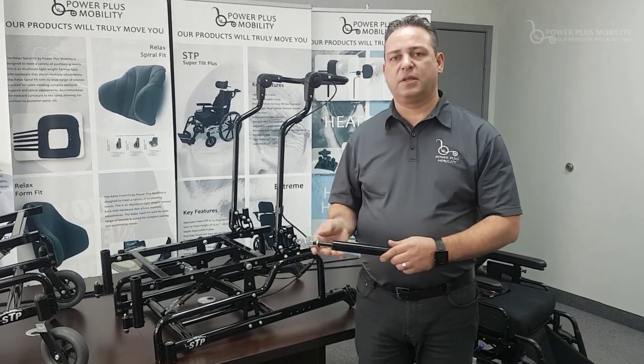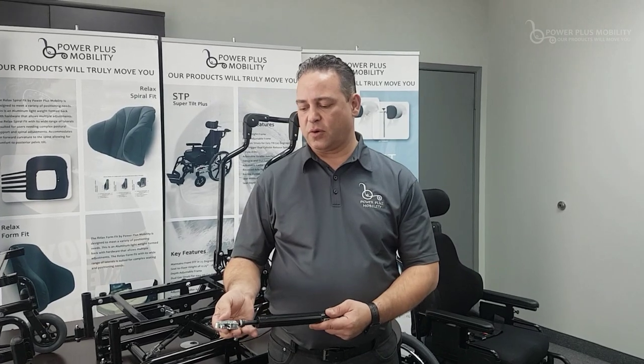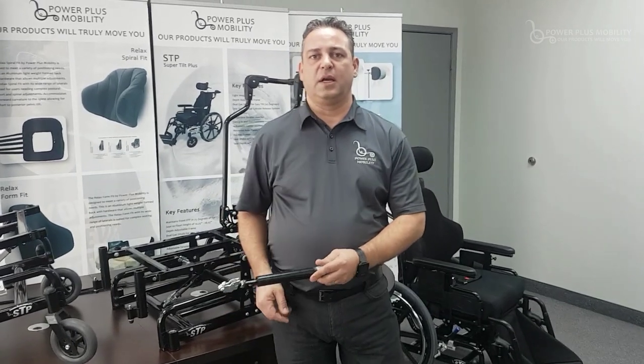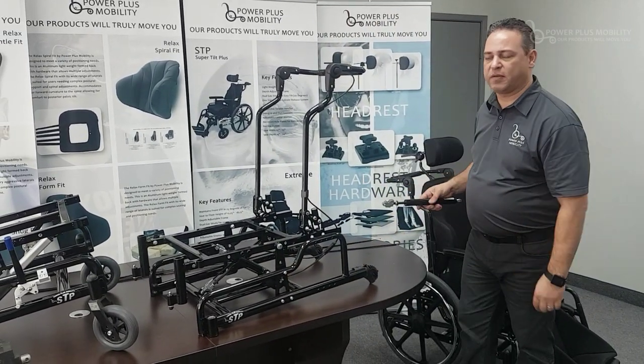Once mounted to the chair, the next step is to attach the cable assembly, which allows the trigger mechanism on the cylinder head to engage back and forth so we're able to tilt the chair through the 0 to 55 degrees of tilt.